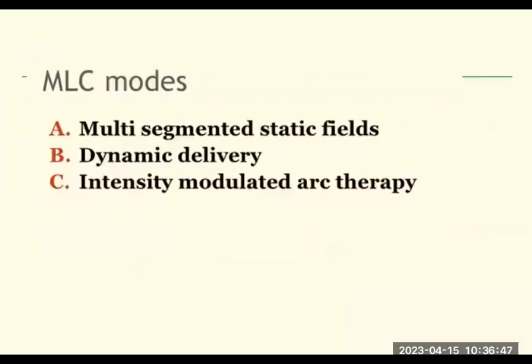So the MLC modes: in the multi-leaf collimator there are three modes. The first one is the multi-segmented static field, the second one is the dynamic delivery, and the third one is intensity modulated arc therapy.